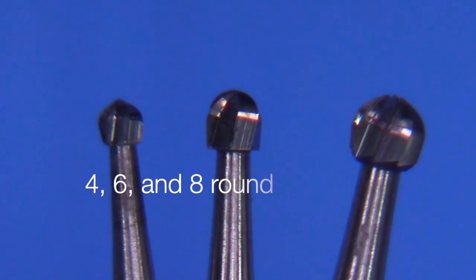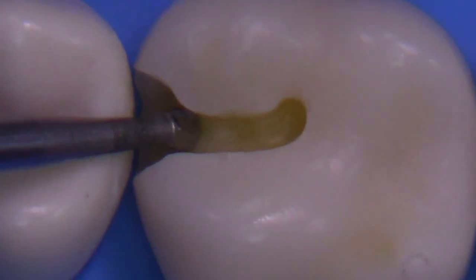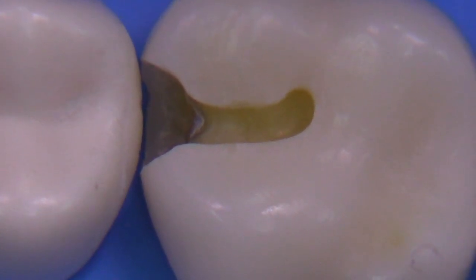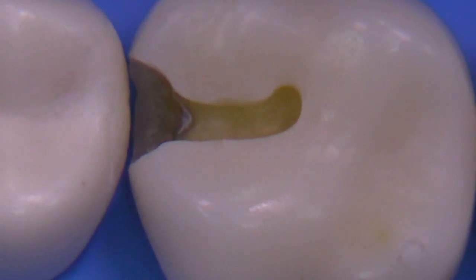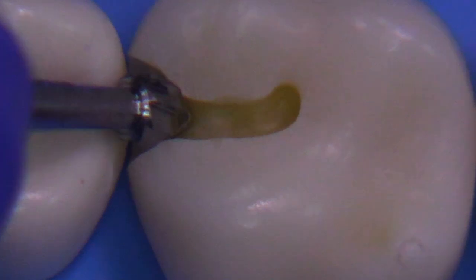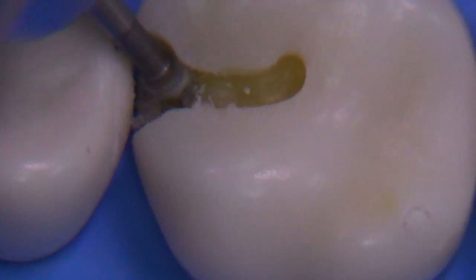We have choices of round burs — I like the largest bur I can fit, so I usually start with either a 4, 6, or 8. The 4-round bur fits easily. Let's see if we can go a little larger — the 6-round bur fits, but it's a little bit tight. I'd be a little concerned about using that, and the 8-round bur has no chance. So I think we've found the right bur: the 4-round, using slow speed with a friction grip attachment.